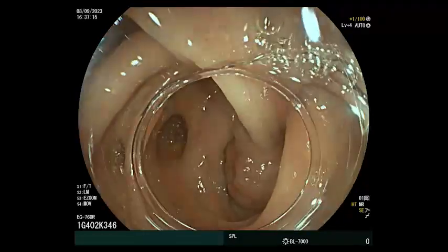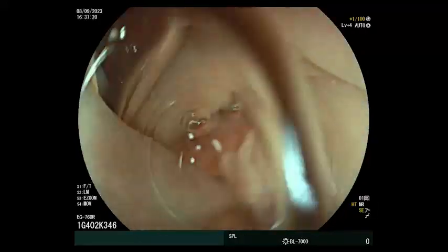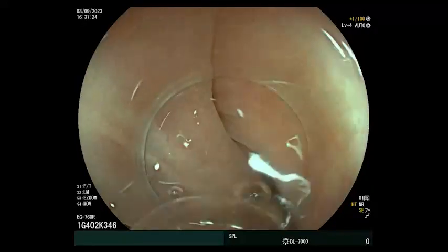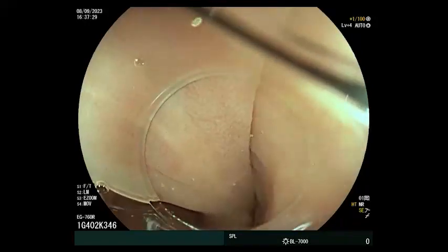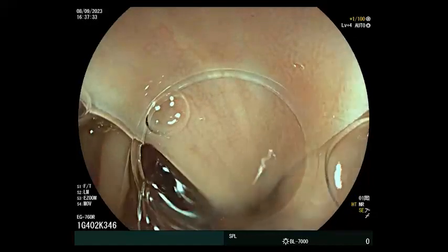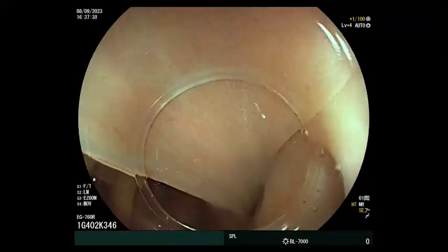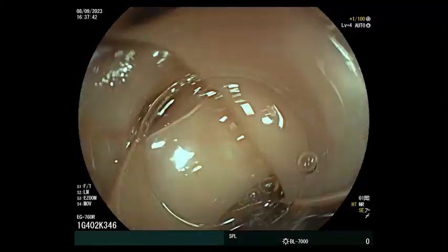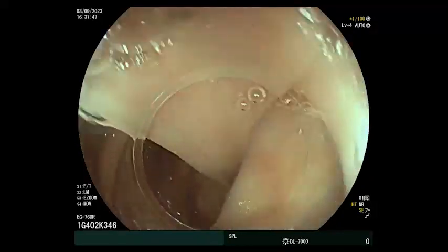And for huge pedunculated polyps, when we have a very large pedicle and a very large head, we have cases like this, me and Mohammed, and we presented one of our cases in the last DDW about a huge pedunculated polyp in the hepatic flexure. The pedicle was about 3 centimeters, and the head was about 7 centimeters, and we used ESD. It seems strange to use ESD in pedunculated polyps, but there are a lot of reports for the huge ones. You can discuss this.